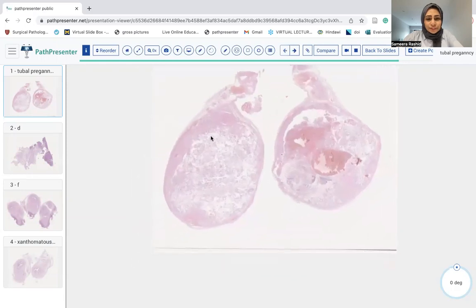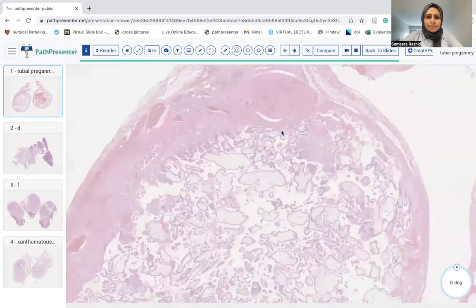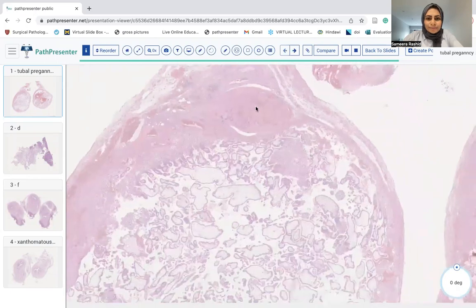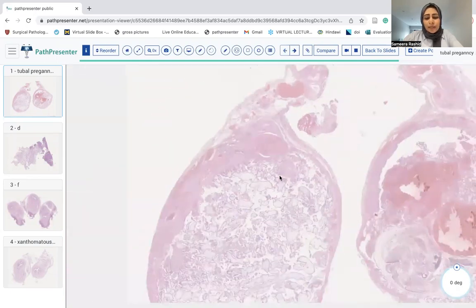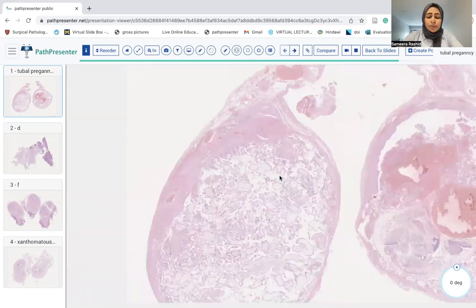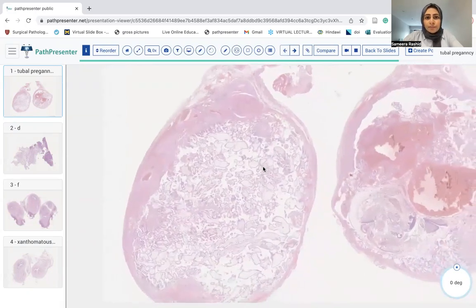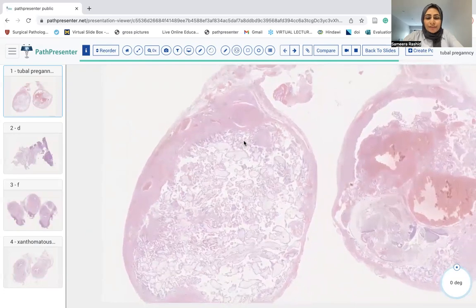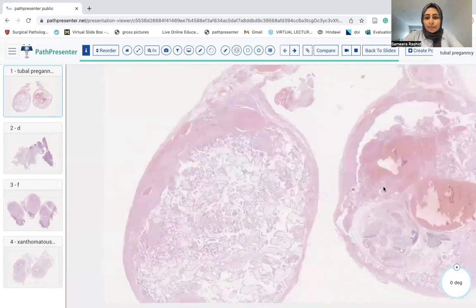This first lesion is not uncommon, and it presents in a female who has abdominal pain and a positive pregnancy test. A uterine ultrasound does not reveal intrauterine pregnancy, and there is some irregularity in the fallopian tubes noted. So the fallopian tube is removed.